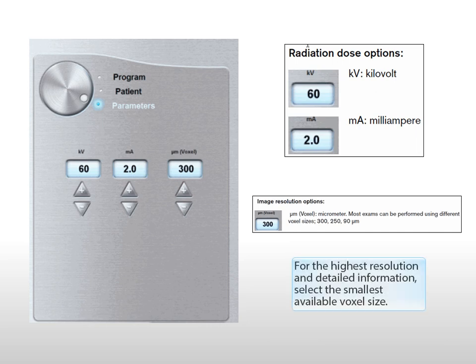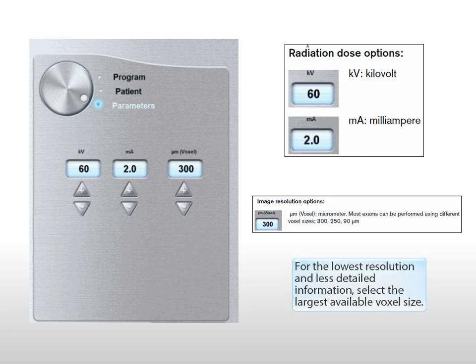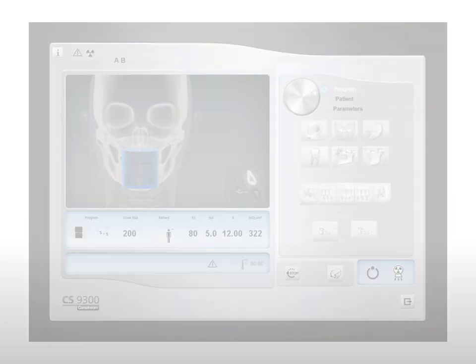For the highest resolution and detailed information, select the smallest available voxel size. For the lowest resolution and less detailed information, select the largest available voxel size.